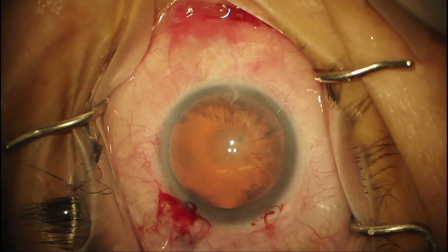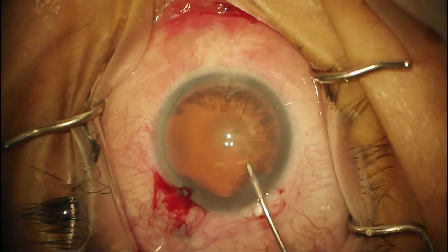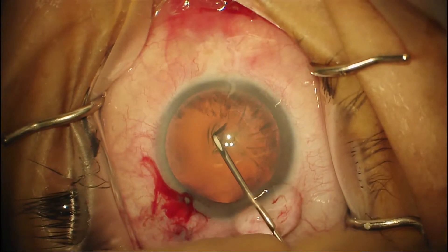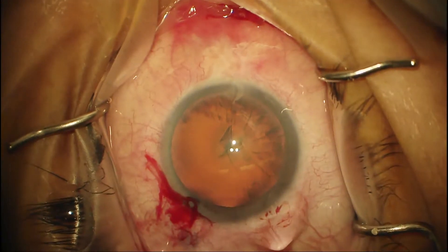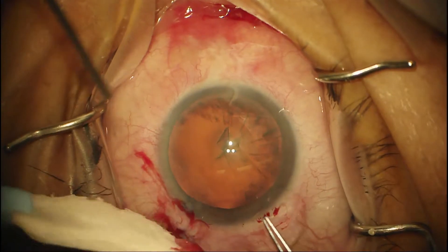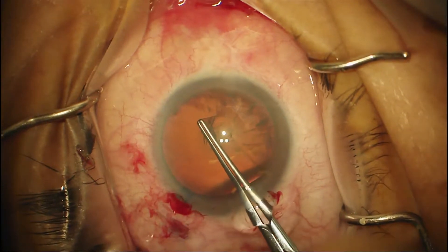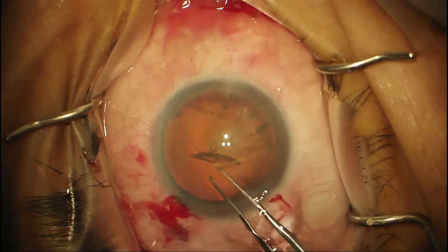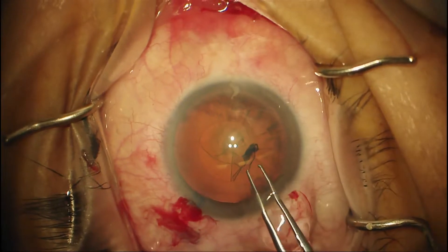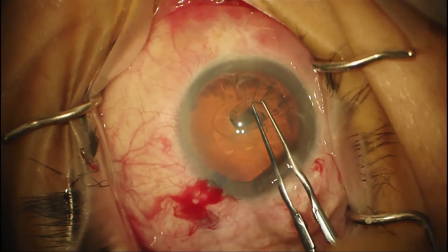Here's the beginning of the rhexis. I use a premade cystotome and create a little slice across the anterior capsule and then make the first turn with that. I prefer using Utrata forceps to using the cystotome for the whole rhexis because I feel there's more control. We aim for a 4 to 6mm rhexis, and you always want to be leading it with the edge of the rhexis folded over. You never want to pull outward, and you always want to re-grasp about 2mm from the side of the tear. That keeps you in control — it's like leading a dog; you're telling it where you want to go next.